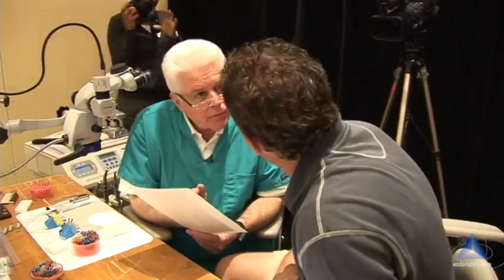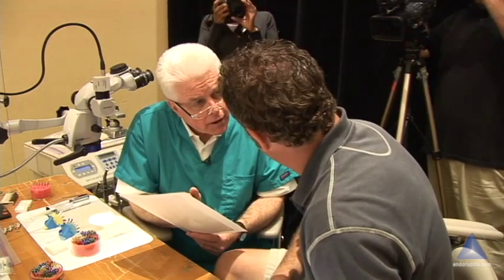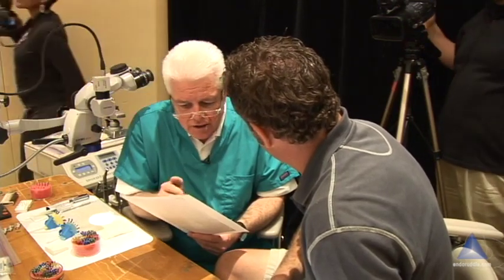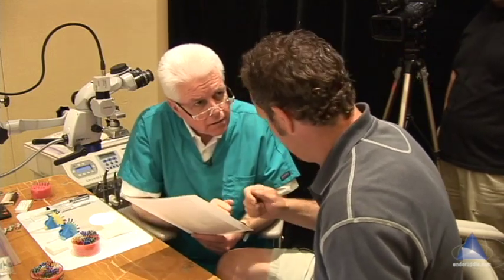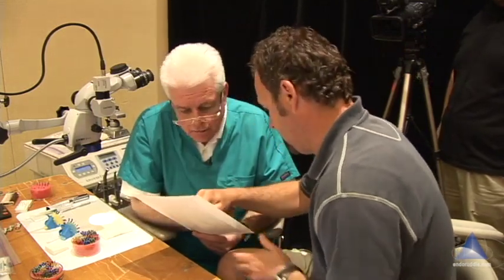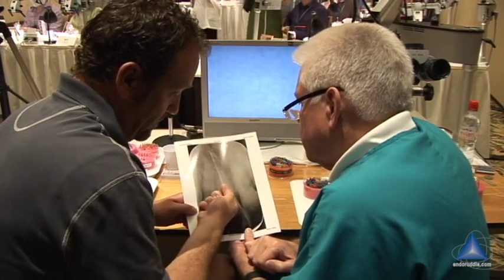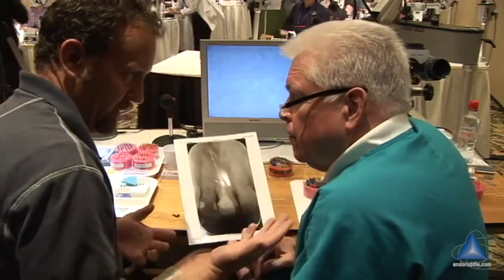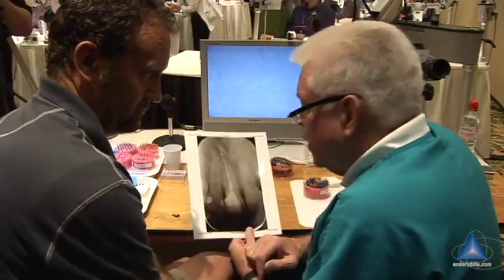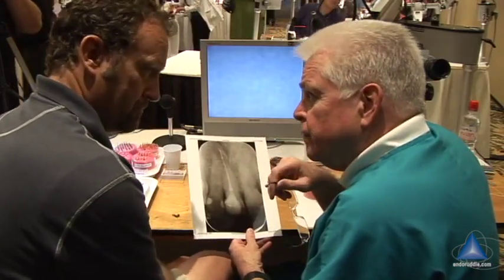Just talk me through this. So you've shaped the canal with your files and you're fitting a cone. Right. And are you using any kind of condensation, or do you butter your cone and seed it? I butter my cone, seed it. I sear it off right here, I start plugging it down, I sear it off a little bit deeper. Oh, so you're doing the classic technique. Yeah, like you did. Classic. How are you introducing the sealer? Just on the cone? Yeah.